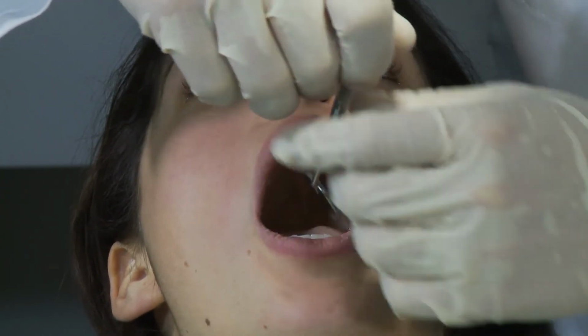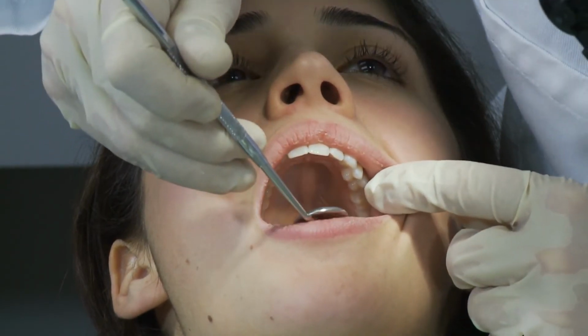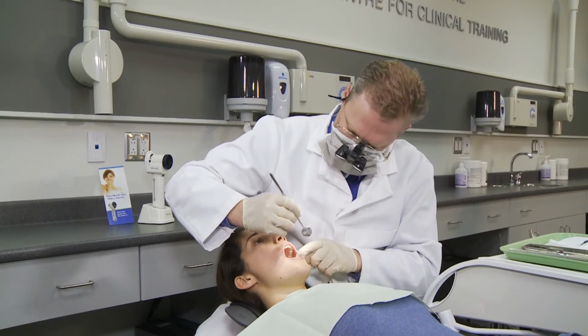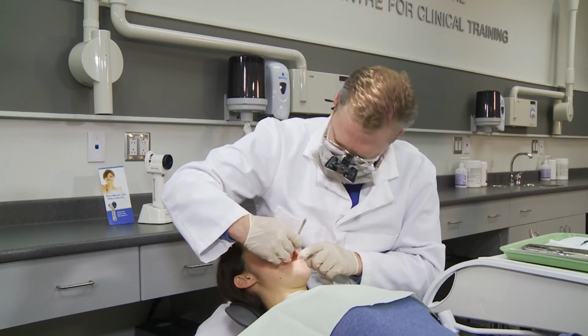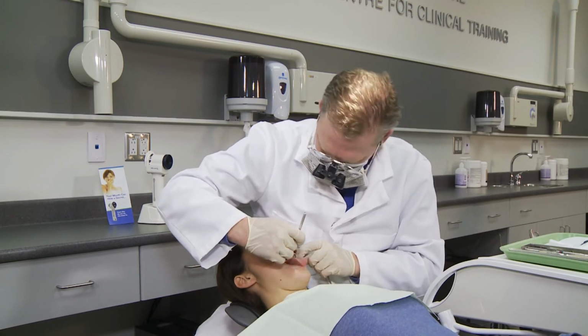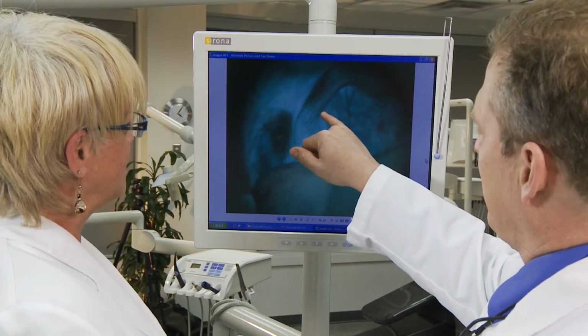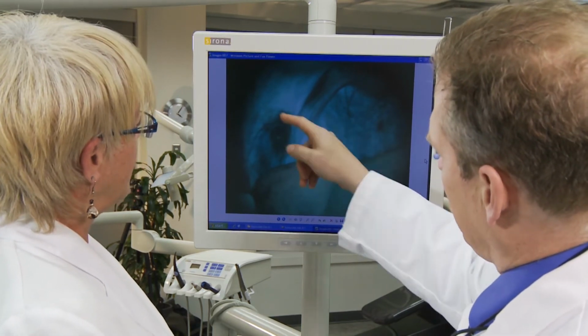treating for oral candidiasis. If the lesion has not resolved after the follow-up time, proceed with further investigation of the suspicious tissue according to your regular protocol, which may include biopsy or referral to a specialist. Your clinical judgment will ultimately determine the appropriate course of action.